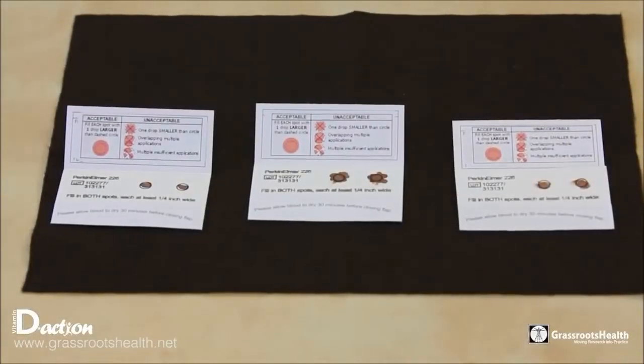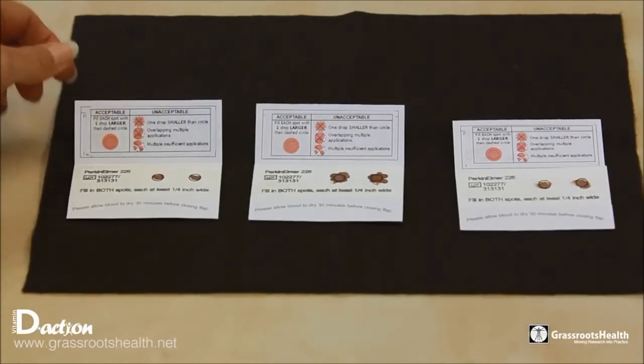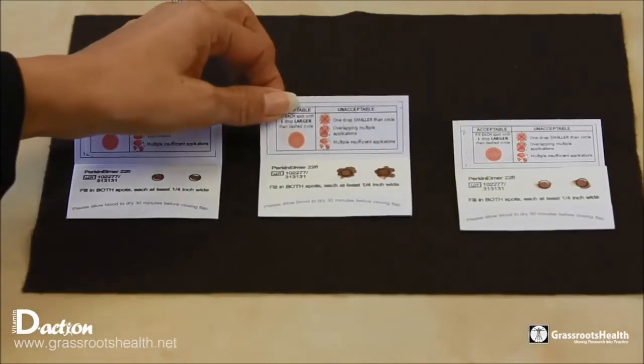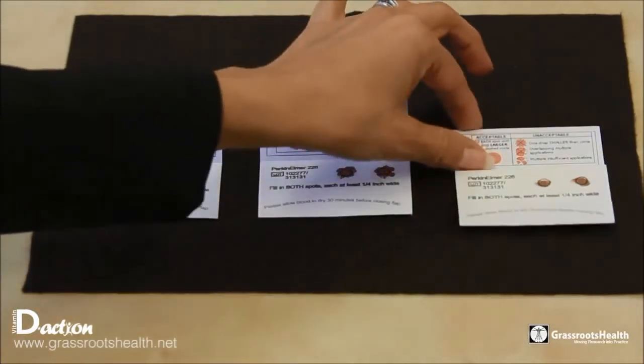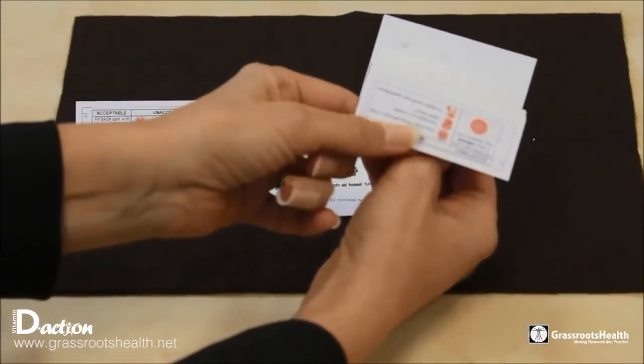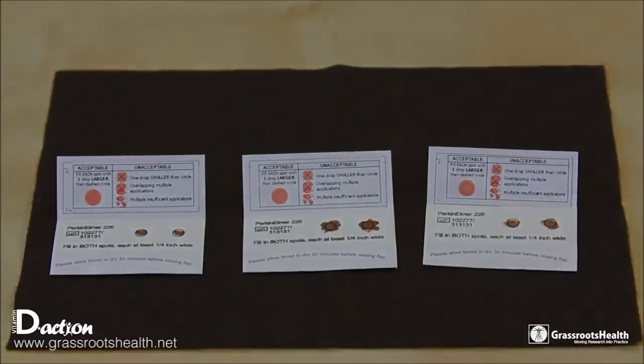Here we want to show you an example of three blood spot cards that would be deemed unacceptable. The first one on your left does not have enough blood in it, and the blood spots are too small. The middle one has overlapping drops, which would also be unacceptable by the lab. This third one — you actually have to look at the back to see that the blood didn't soak through. So all three of those are conditions you want to avoid in creating your good blood spot card.